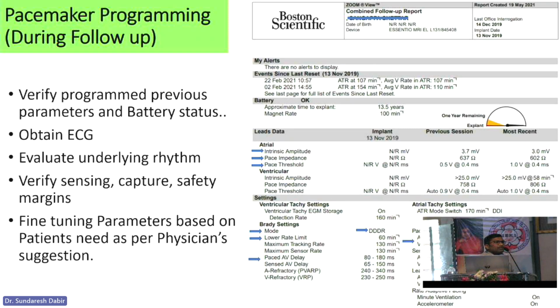Let's say the patient has come from outside, and it's the first time you are seeing maybe a 10-year-old pacemaker. You should not straight away put the band on for interrogation. There may be only one or a few days of battery life. If you interrogate, it can go off, then the patient may arrest, or if an escape rhythm is present, the patient goes into CHB.